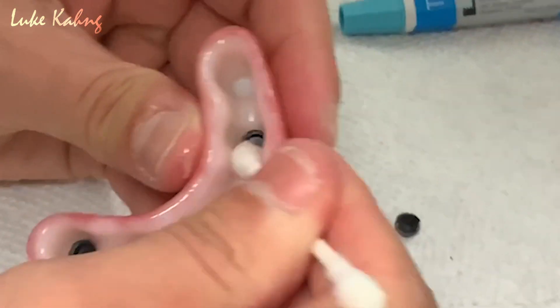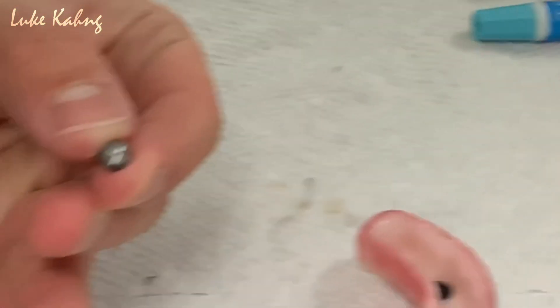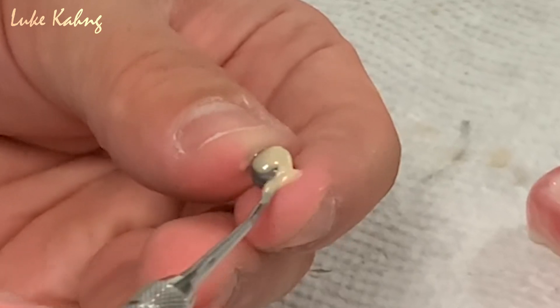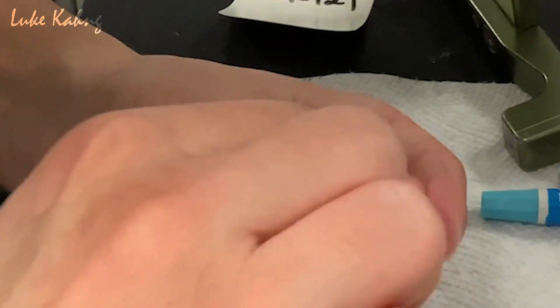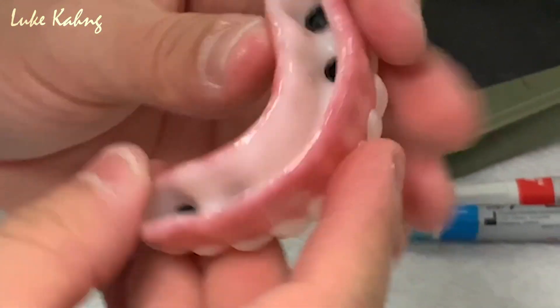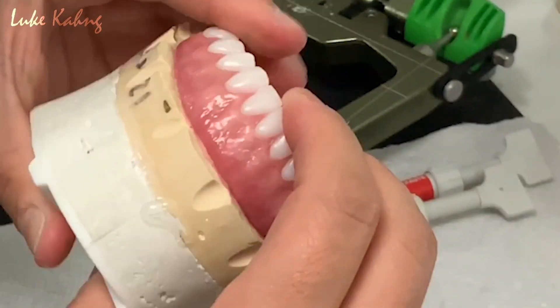Make sure to clean off any excess paste. After applying the attachments, make sure the locator fits to the hybrid bar with the correct occlusion.